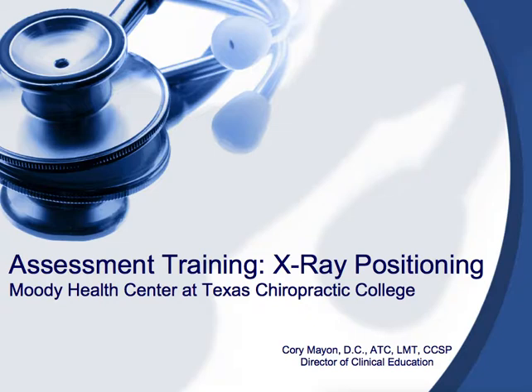Throughout students' clinical experience, they're required to do various X-ray positioning assessments. This training module will cover what those assessments include and an example of going through one of those assessments.